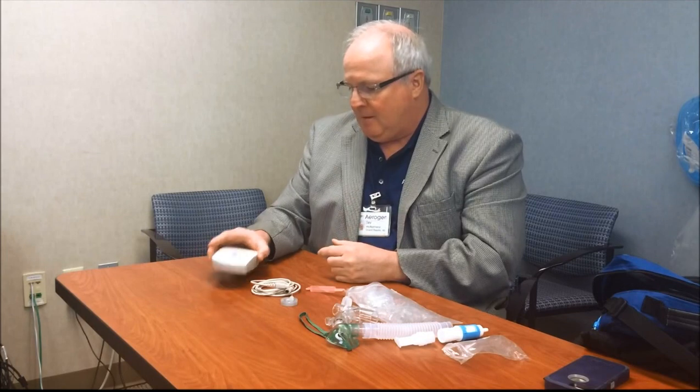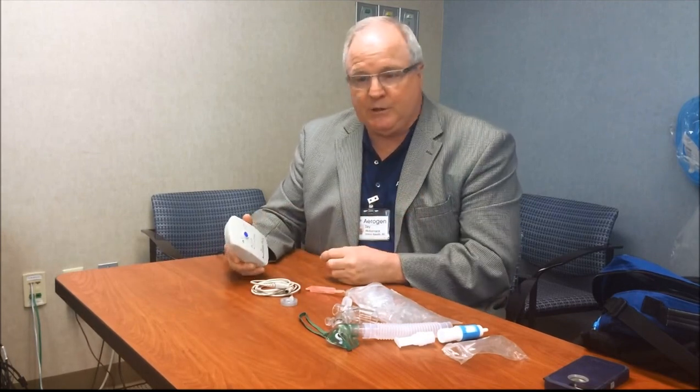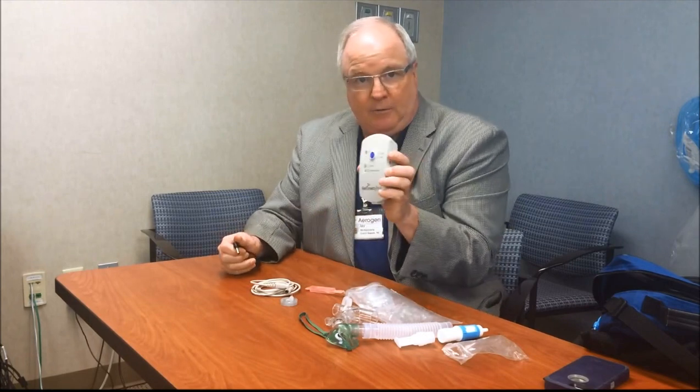I'm the clinical specialist for Aerogen, and I wanted to show you how to operate the Aerogen Solo device for use for inline nebulization. Basically, the system itself, as far as hardware, consists of three components. First, you'll notice is the Aeroneb controller.